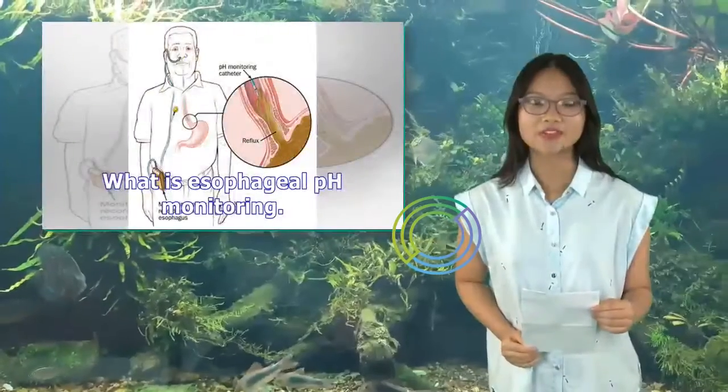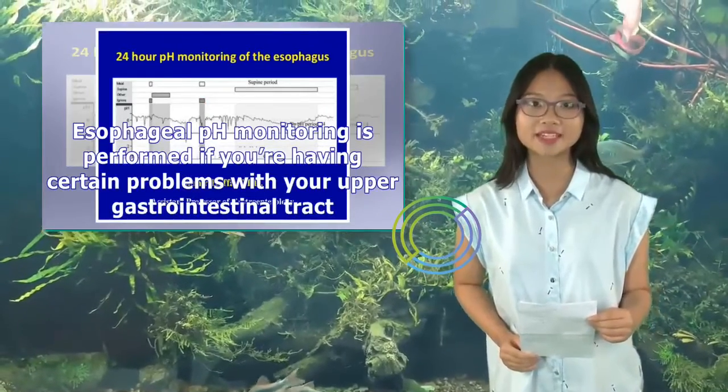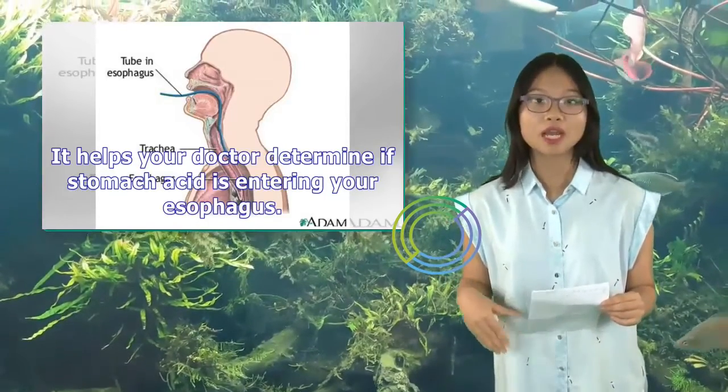What is esophageal pH monitoring? Esophageal pH monitoring is performed if you're having certain problems with your upper gastrointestinal tract. It helps your doctor determine if stomach acid is entering your esophagus.